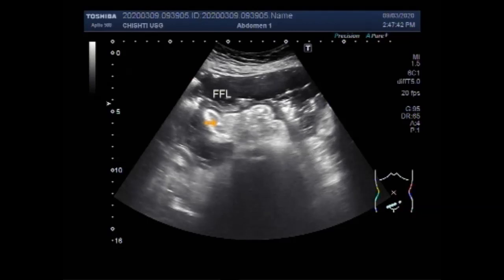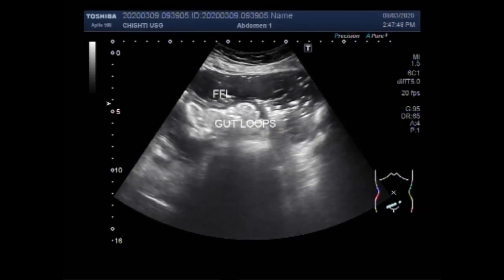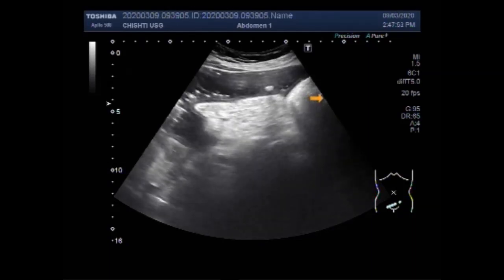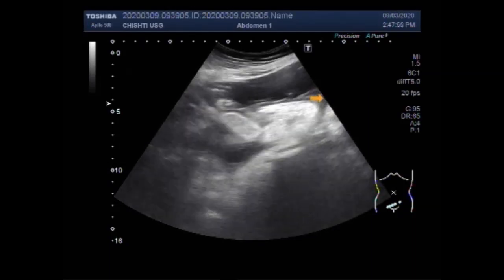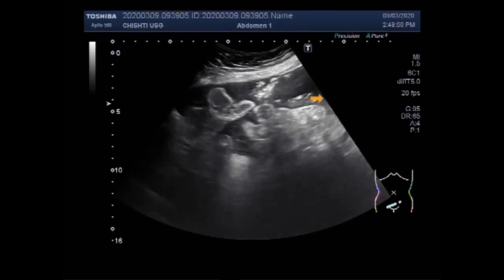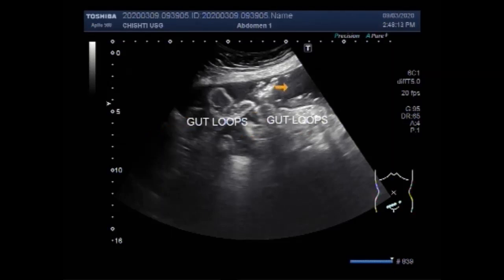You can see the free fluid in the lower abdominal cavity. No fluid was seen in the upper abdominal cavity. These are the gut loops in the lower abdominal cavity. The gut loops are showing no intestinal movements — no movements are visible. This is the free fluid in the lower abdominal cavity.